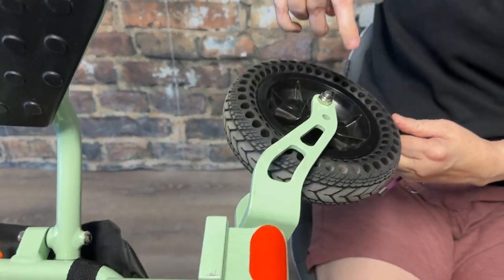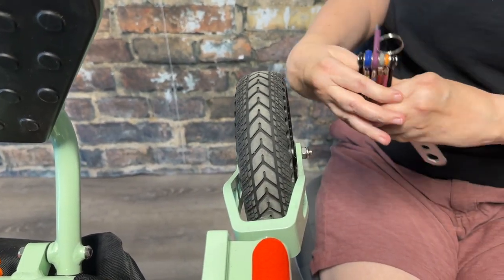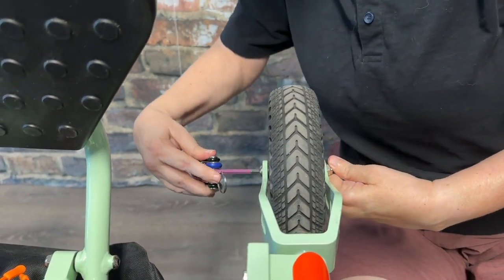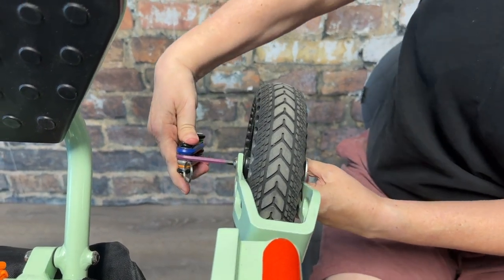Next we're going to look at the front caster wheel. There is one bolt holding that wheel onto the frame — same purple head. Tighten that bolt, take the makeshift wrench, and put that on the nut.